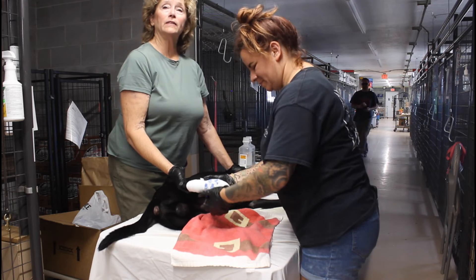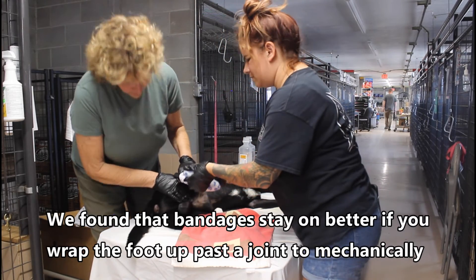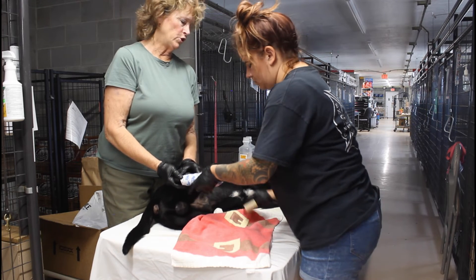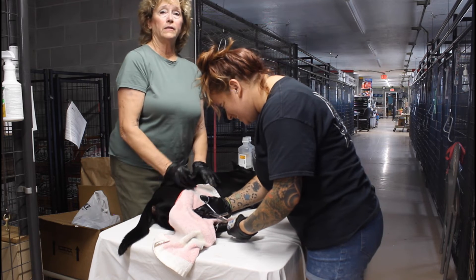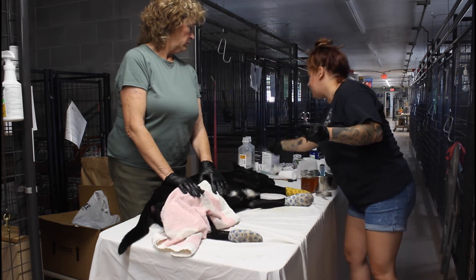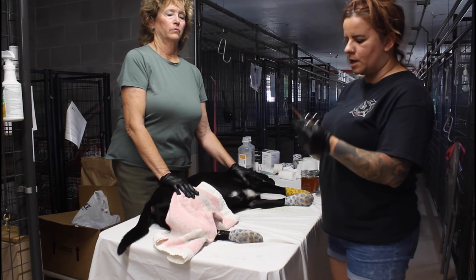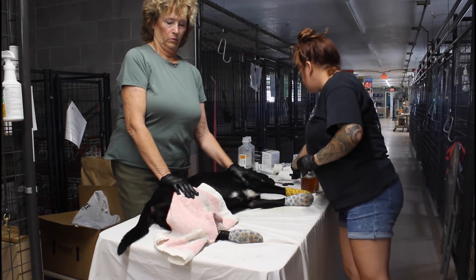These bandages can still slip off because we don't want to make them so tight that we cut off circulation. Also, these are bandage scissors — there are a couple of different sizes. It's very important when you take off bandages from a dog that you don't use straight scissors. It's super important that the scissors have a little protector on the bottom so you're not accidentally cutting anything that doesn't need to come off.